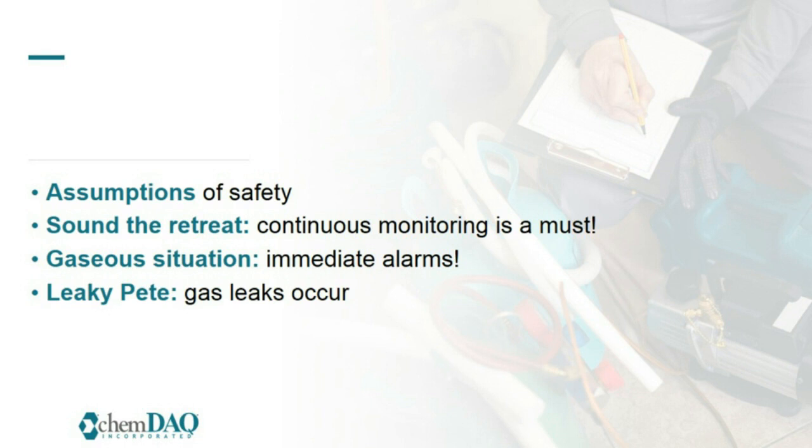These sterilizers can and do break down and malfunction. It's very important that you're performing your daily and your weekly preventative maintenance on these machines to make sure that they continue operating the way that they should. And it's really interesting when you go on to think about it. Continuous monitoring is a must.